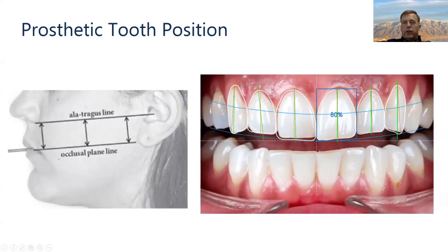And then there's a few other little rules that are helpful. In general, we want our centrals flat to the front. So in other words, when you look at them in profile, or you look at them from the incisal edge, they look fairly flat. Some cases look better perfectly flat. Some look better, I feel like, if you follow the curve of the arch slightly, but something to think about. We want these main line angles to be symmetric, cross arch. Sometimes if you're working on a big case and you look at the teeth and you think they ought to look good, but they don't, look at them from the incisal edges and look at the morphology, and you'll find the problem is that they're asymmetric in terms of the facial profile.